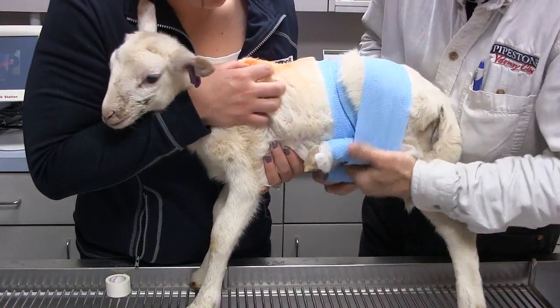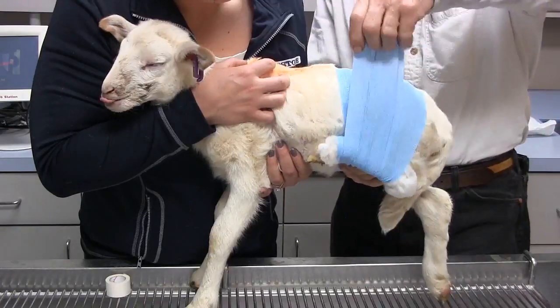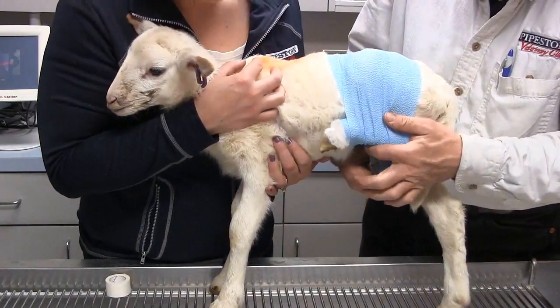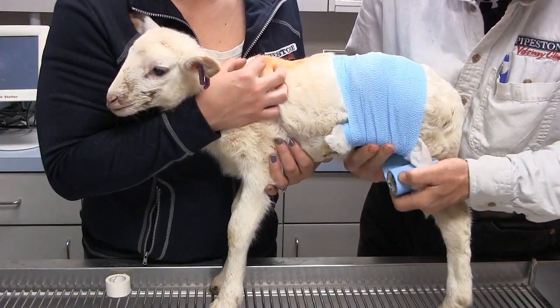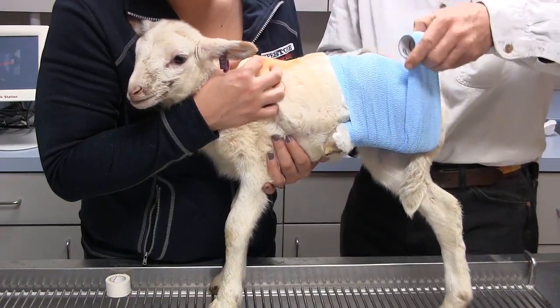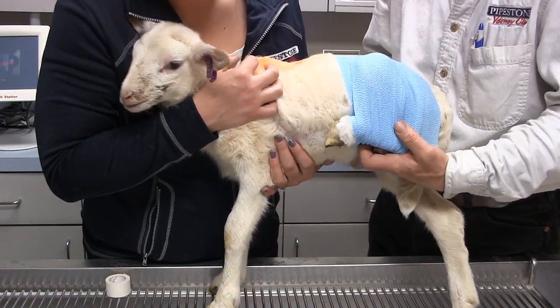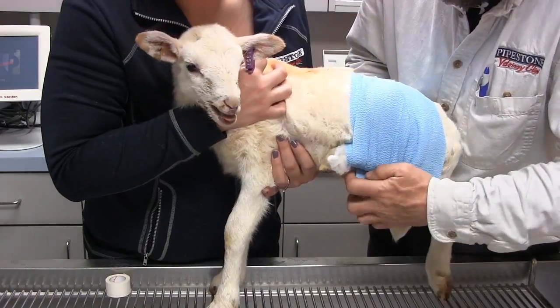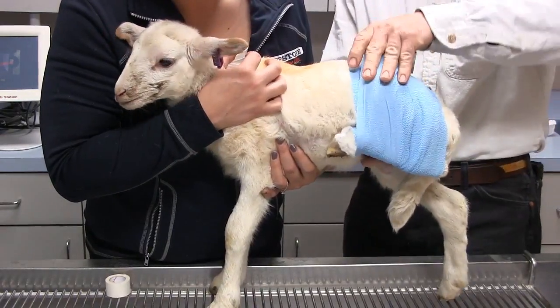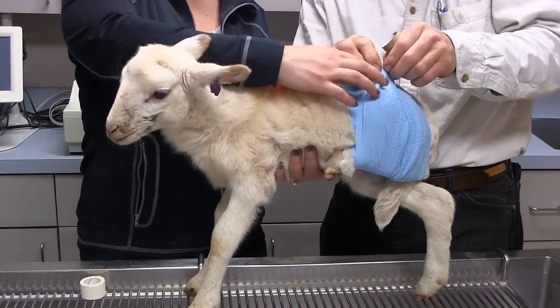This gets to be a bit more complex. We have the problem that we didn't have in the front leg, and we need to make sure the lamb can urinate if the lamb is a male lamb. So once we get the vet wrap secure, there are times where we may have to cut a little bit to allow the lamb to urinate, and we'll demonstrate that shortly. We may have to add a little bit of either elasticon or white tape to go ahead and secure that.